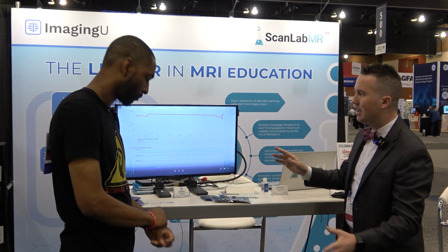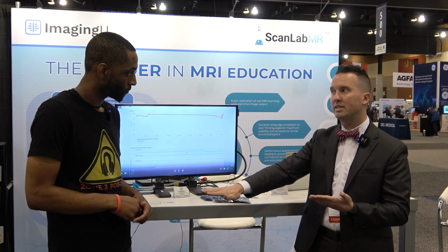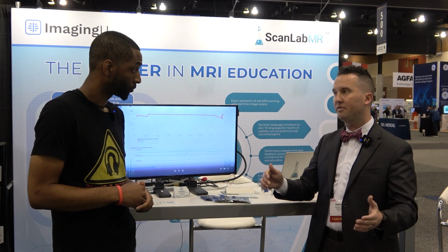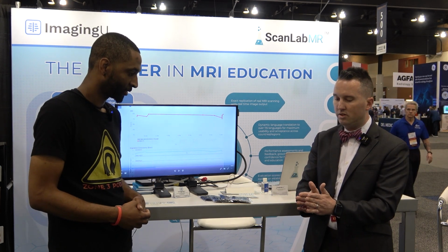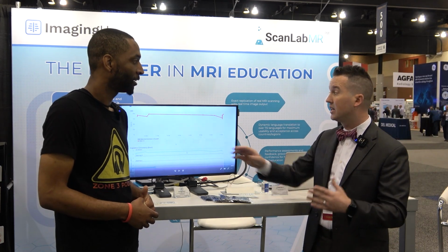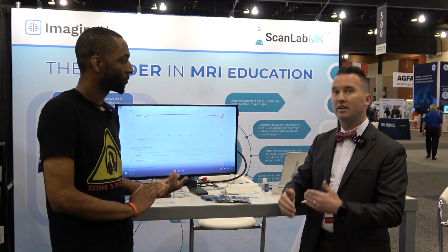So let's say, hypothetically, this person inside of their ScanLab, there are 2 or 3 assessments that we do, because in order to get an angulation consistency, we have to do multiple time points. If you're hiring somebody, we just do one time point and you see who they are. But if you have your staff that you want to assess and see what the possibilities are to improve them, we do 2 brains, 2 knees, 2 lumbars, everything like that, so we can start to get the angulation consistency. Because it's one thing to do a one-off and do a good job. Exactly. But it's another thing to actually do anything consistently.